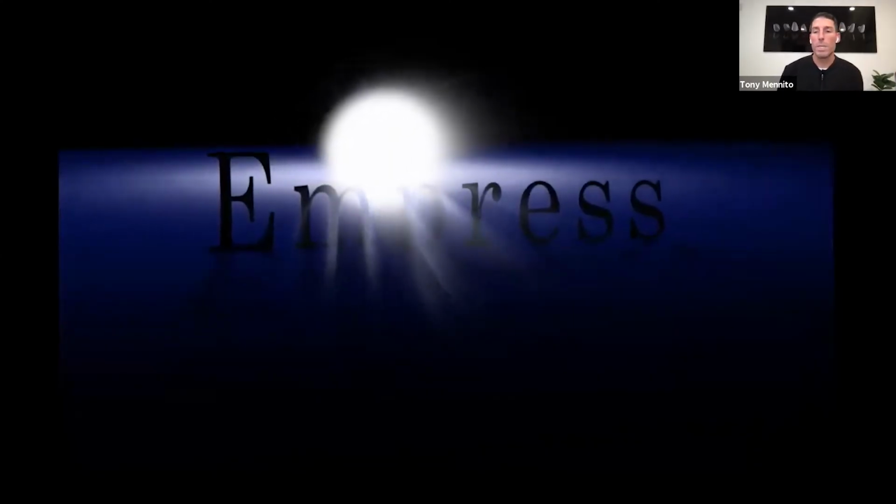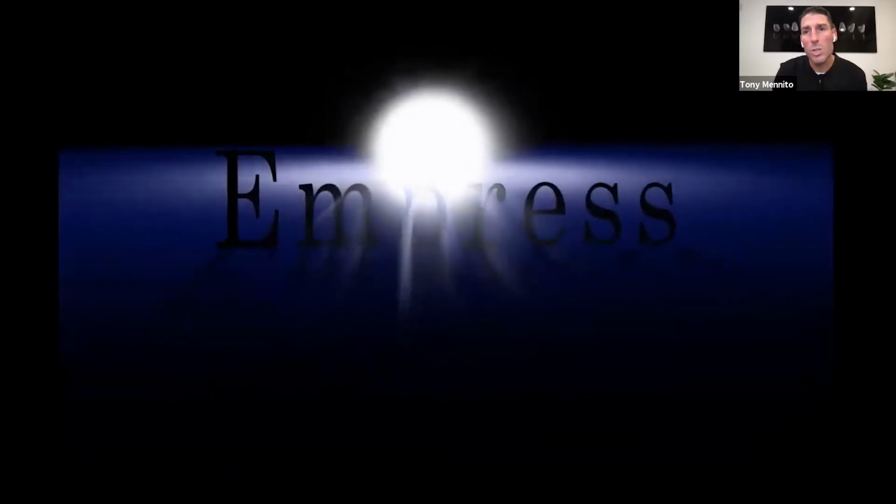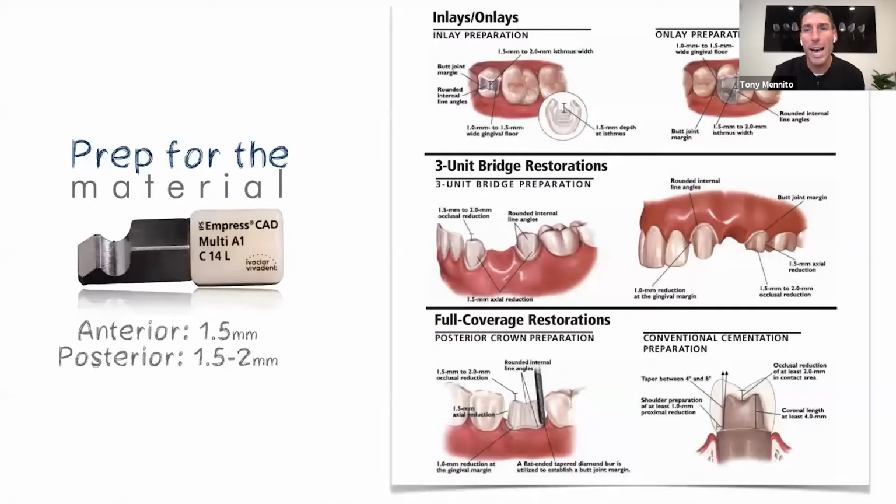So let's move away from emax and talk about Empress. Empress is a little bit of an older material, but I think it is the prettiest material that we can mill in our mills nowadays. For really aesthetic cases, Empress, and specifically this block that you see on the screen, Empress Multi, is my favorite block. It is beautiful, y'all. There is a built-in gradient in this block that basically makes it look just like a natural tooth.